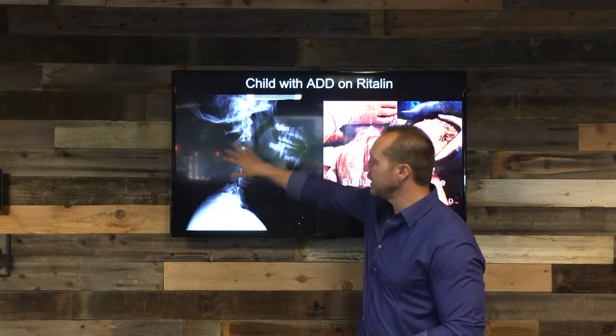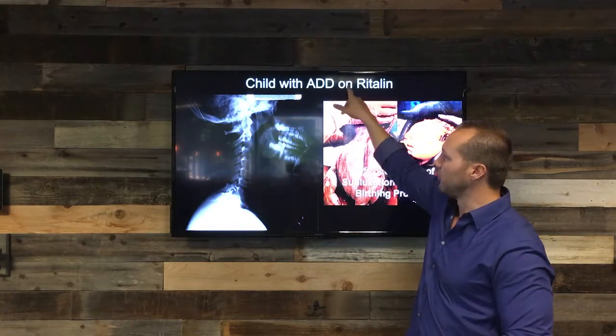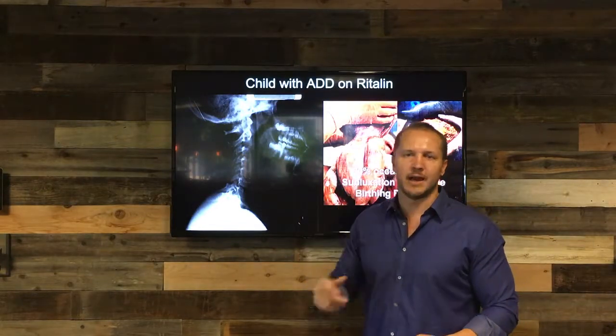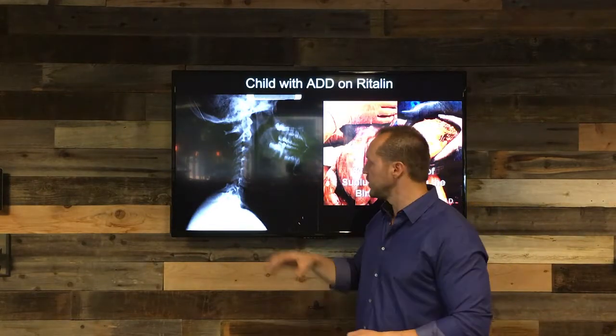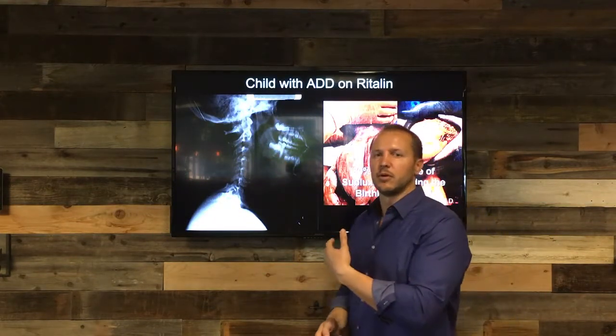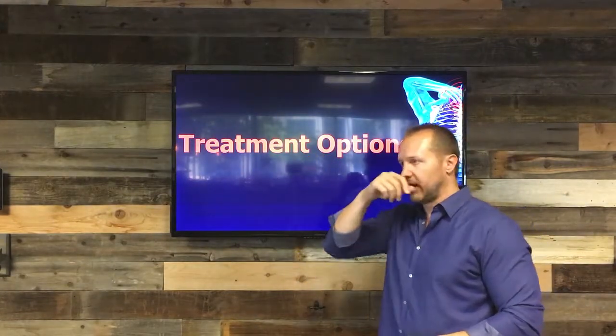This is an x-ray of an 8-year-old who's already lost the curvature of his neck. He's already on Ritalin for ADD, and he already has a lot of headaches, which children don't typically have at that age. But again, with technology, some of the birth trauma, it's not surprising that we're finding more of this stuff going on. So real quick, we're going to go over the treatment options, and then I'll wrap this up.